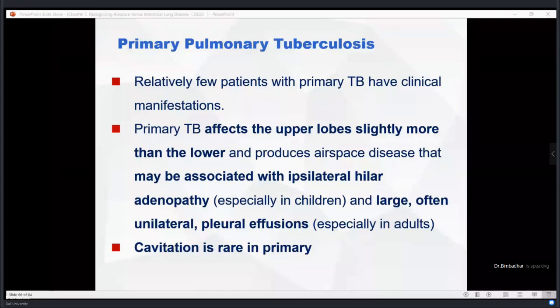Now he comes to your hospital. Can we call this tuberculosis? He's from the US, okay? Why not? It fits your diagnostic criteria, right?